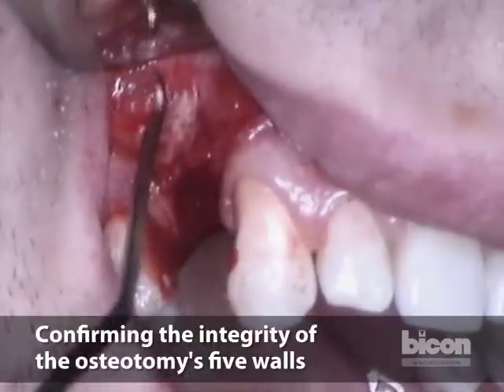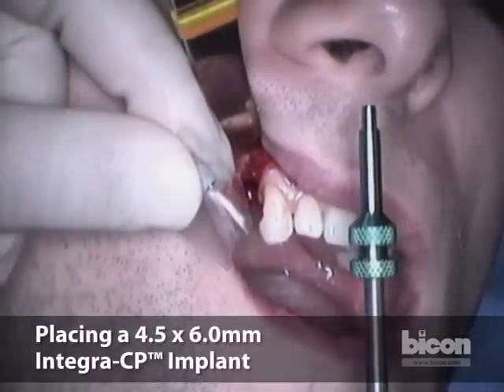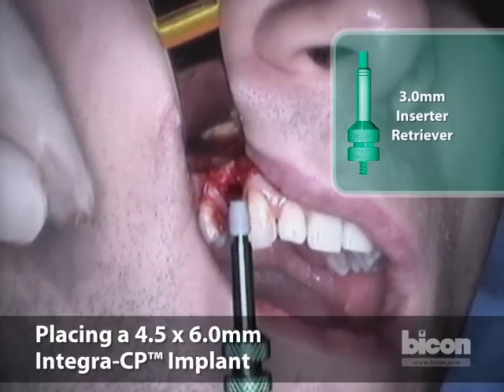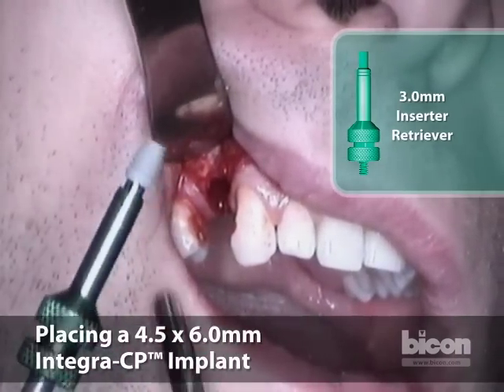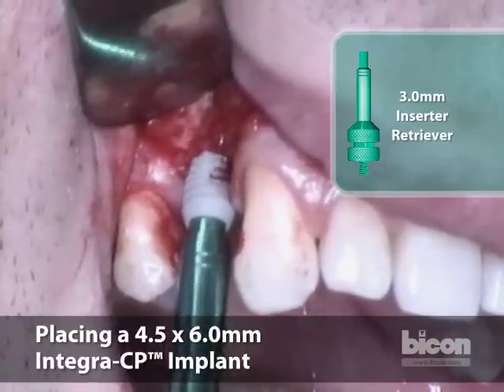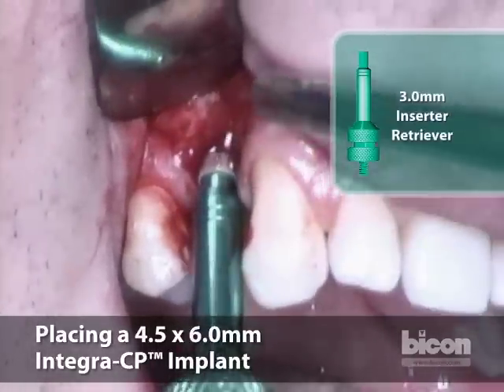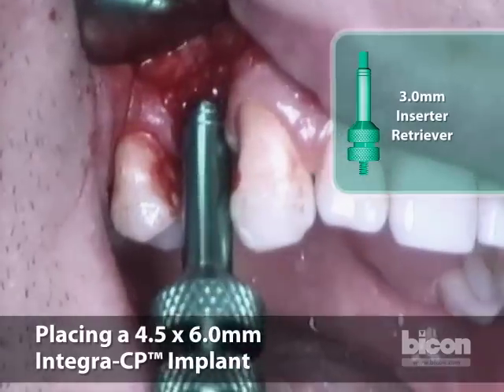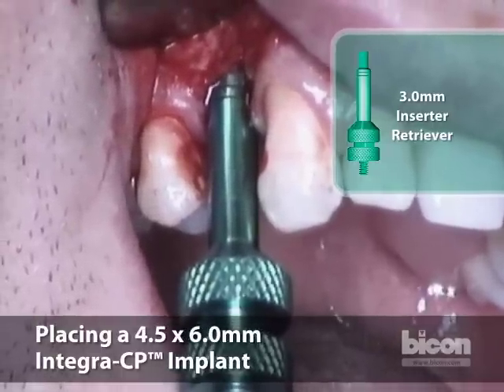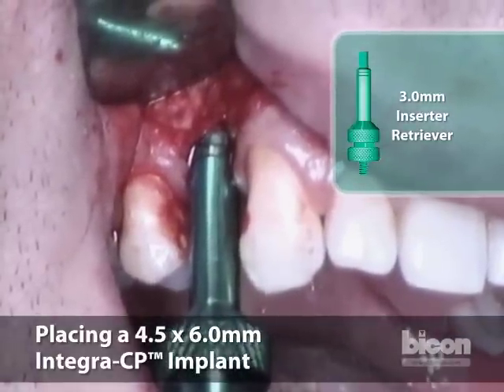The distal wall is intact as well. We know this is the apex of the adjacent bicuspid and we are well away from it. We will engage the inserter-retriever, which also has depth markings at 2 and 3 millimeters. We want the implant to be between those two marks from the crest. The implant is not a screw, but it can be twisted in place, which gives it more stability. Looking closely, you see those two lines — the top of the crest from mesial and distal is between those two marks.